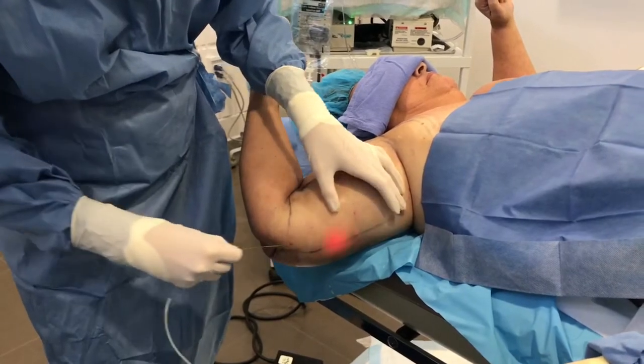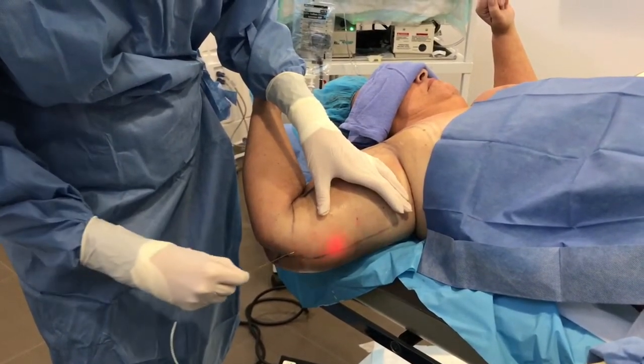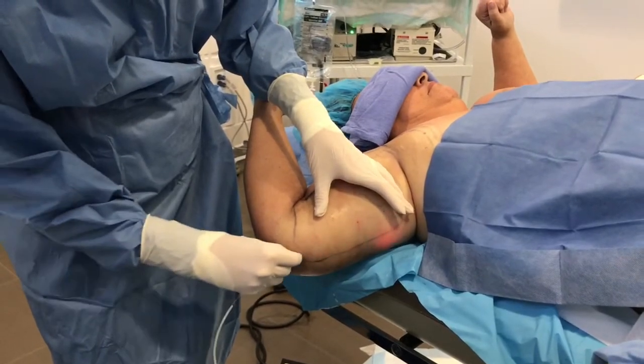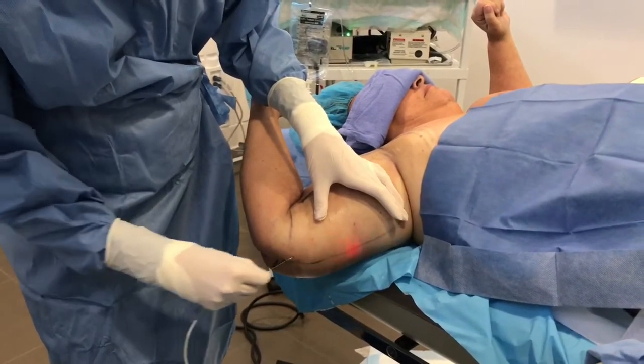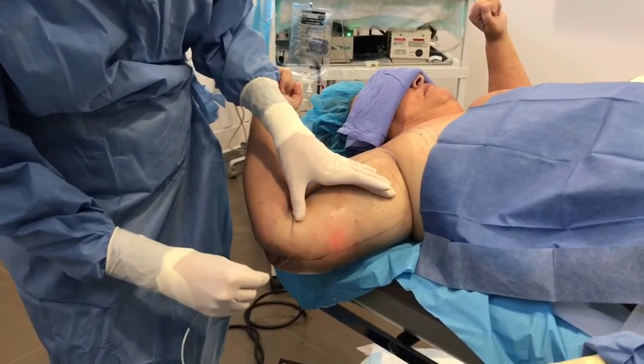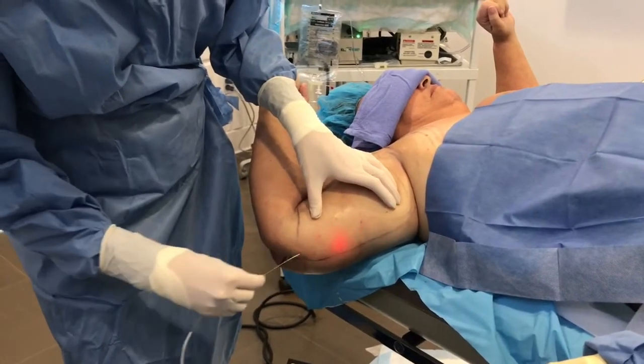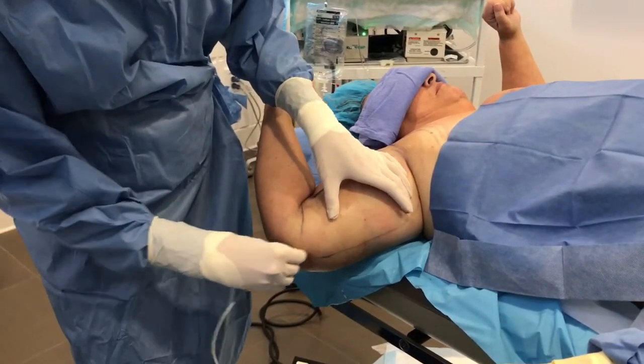I use this a lot in certain areas. AcuSculp is really helpful for tightening up the upper arms. I use it underneath the neck for double chin during that liposuction procedure, and then also occasionally in areas that have laxity, such as the back, or areas like the lower tummy on women where they sometimes have some laxity, especially after childbearing.